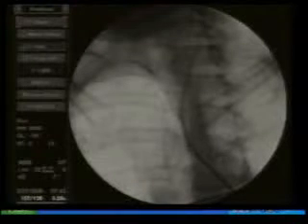And if you look in the left groin, you can see that we have a venous sheath. So that's what we'll use to create our fistula. So you see the sheath tracking around into the common carotid. This sheath has a real long dilator on it.